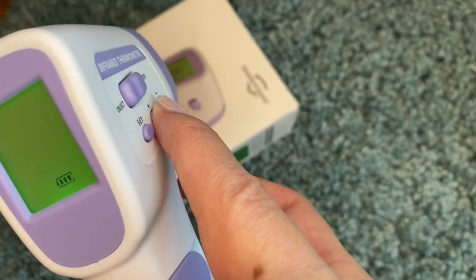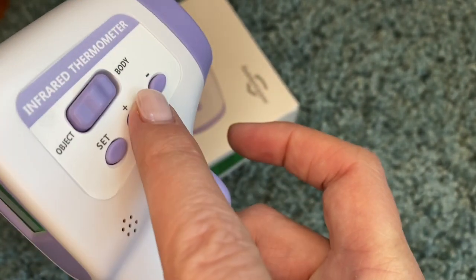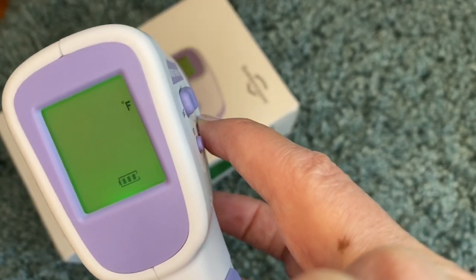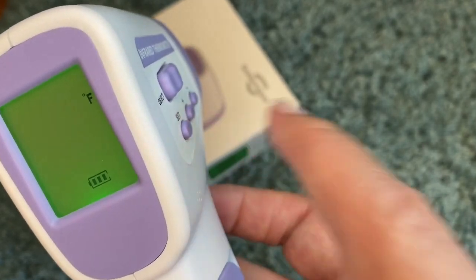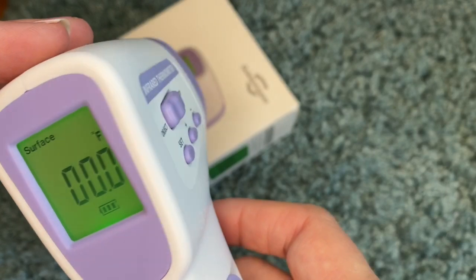Now you're at the setting for that and you're going to use these two buttons. Doesn't matter which one — the up or down, plus or minus — and you're going to switch back and forth between fahrenheit and celsius. Leave it on fahrenheit and then push the trigger again and it goes right back. The rest of the instructions with this are pretty clear.